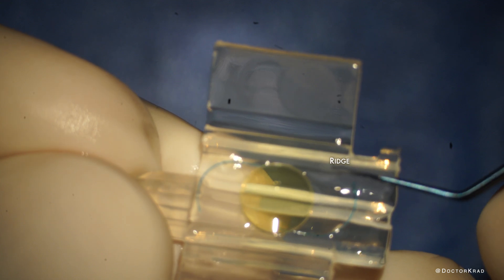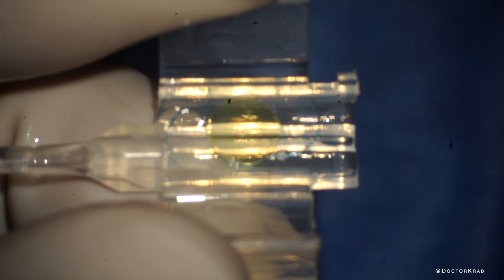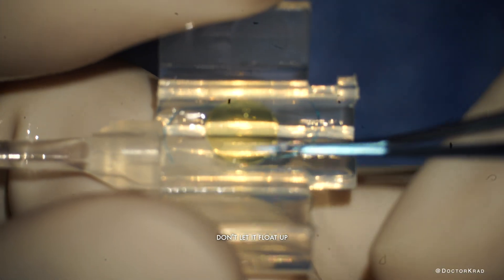It's very important to note the location of these ridges. The edge of the optic needs to be tucked under these ridges. As you close the flaps the lens will tend to float up. So you want to make sure it doesn't float up above these ridges.